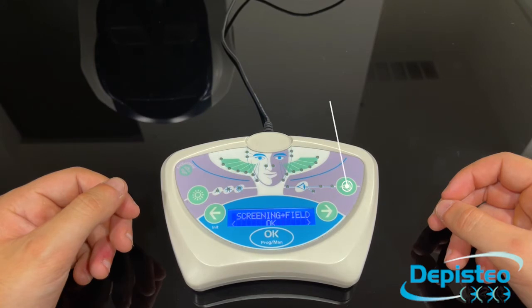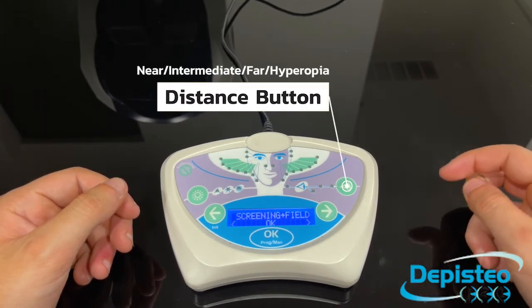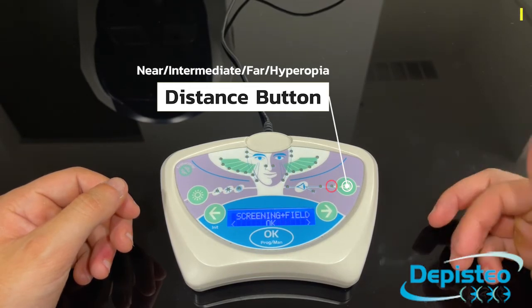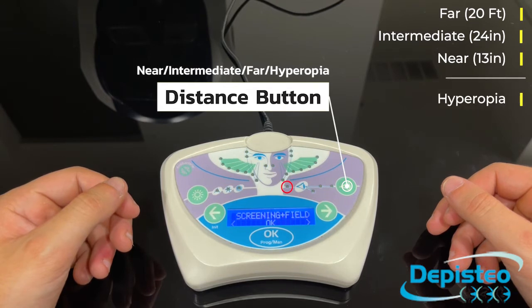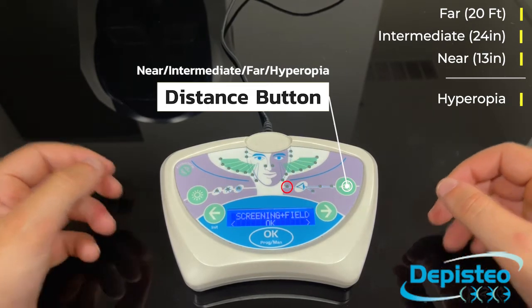And finally, we have the distance setting. This button will let you adjust the distance for the test that you are currently performing. It goes from far, to intermediate, to near. The last distance on the very left is for Hyperopia. If it is available for the test that you are currently performing, you can select it using the distance button.